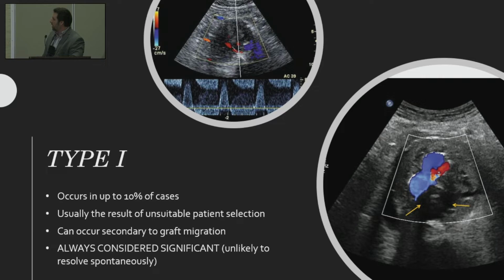Here's a picture of the proximal stent attachment, and we can see all this flow outside of it. So here is the aorta, and then the graft inside of it, and then we see all this flow leaking out at that stent attachment. And then the waveform in one of these is very to-fro and turbulent, and it's definitely not going to be triphasic, monophasic like our normal waveforms.